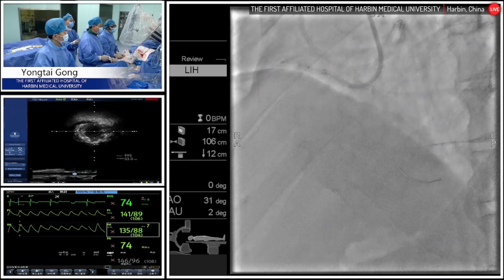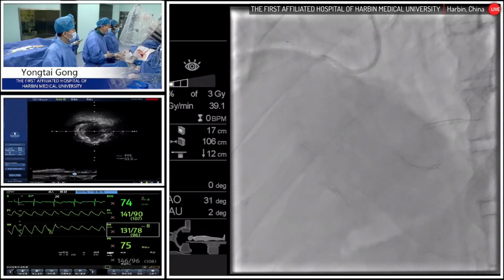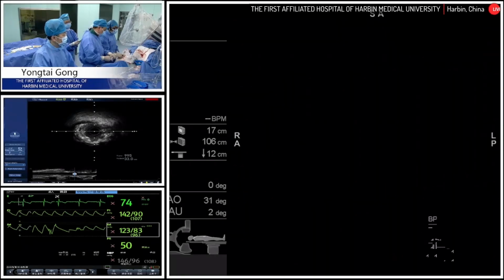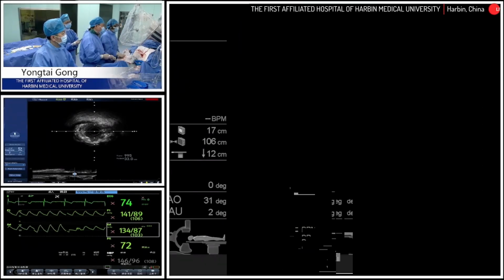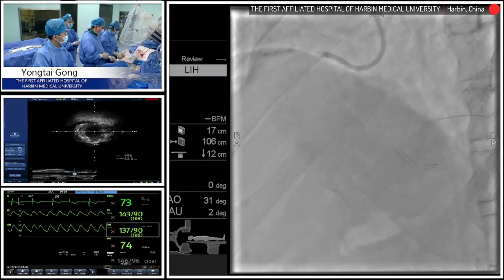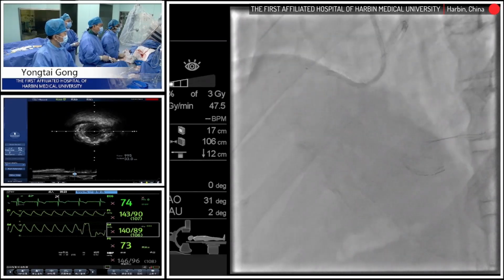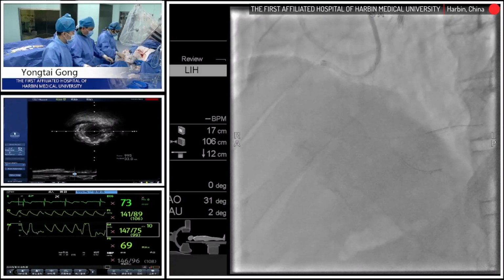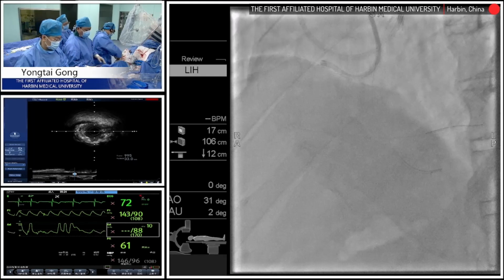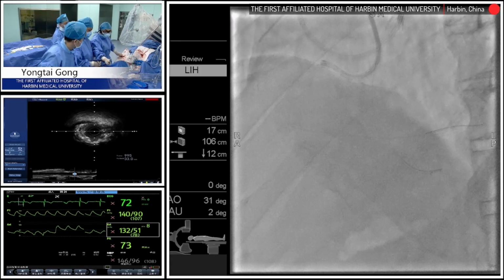One thing is that we use it as a bilateral angiography tool, so that we can confirm the antegrade wire position, just like Professor Gong just did. Whenever a CTO wire passes through the CTO segment, it's hard to identify whether the distal part is in the true lumen or not. Yes, you can perform tip injection. However, we need to emphasize that this procedure carries a high potential risk of causing, for example, hematoma and dissection if the distal wire is not in the true lumen. So bilateral angiography using contralateral injection is relatively safe.